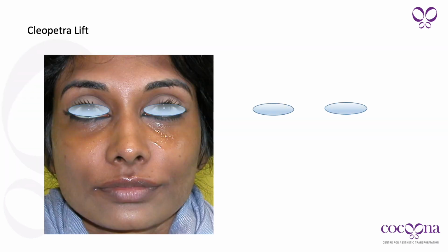Now this is an overall pretty lady who just wanted some enhancement of the facial structure and some lip enhancement. So I've injected Teosyal RHA density 2 into the tear trough region and the lateral palpebromalar region. Teosyal deep lines to enhance the malar region using cannula technique.